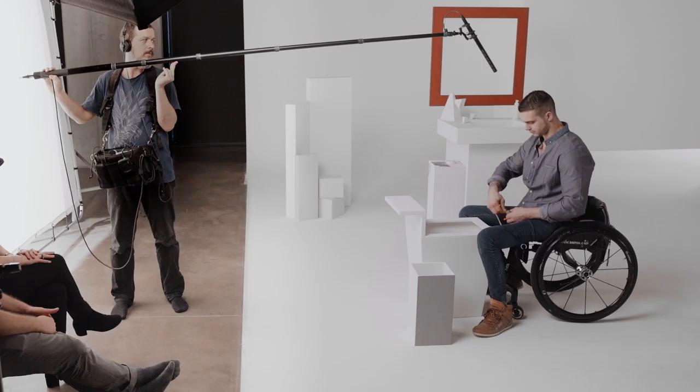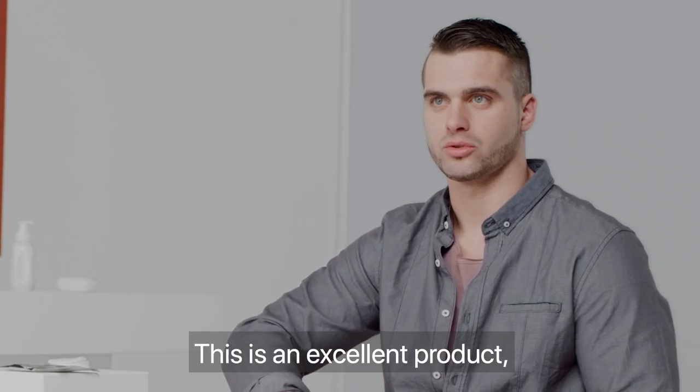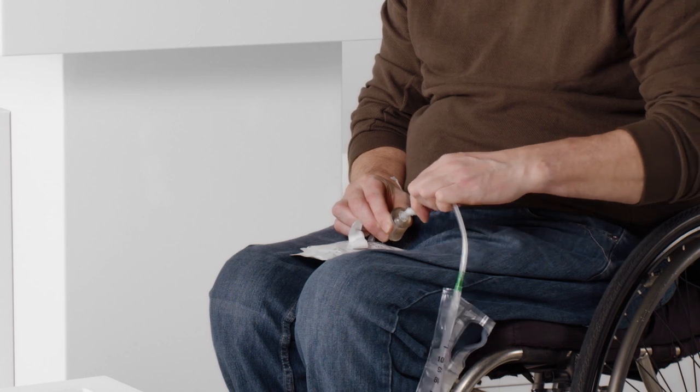Insert the tip until the plate comes in contact with the urethral opening. It takes 2 seconds — it's really easy. It's an excellent product because it's well lubricated; you don't have any pain. The protection on the catheter itself allows me to easily work the catheter so that I can insert it to a point where it reaches my bladder.